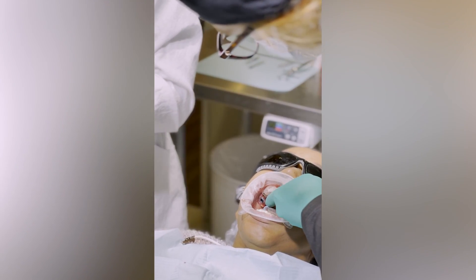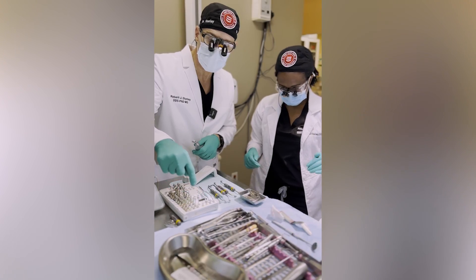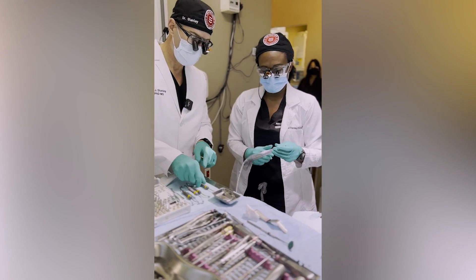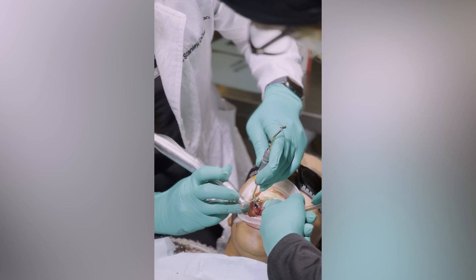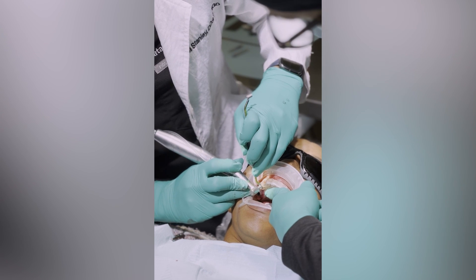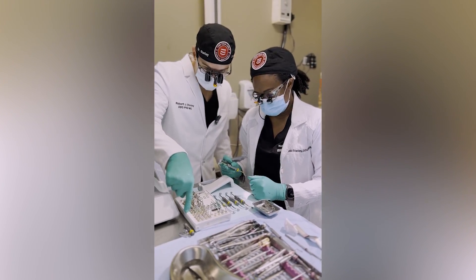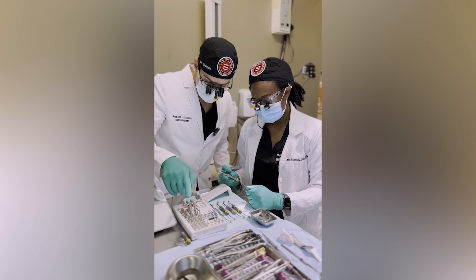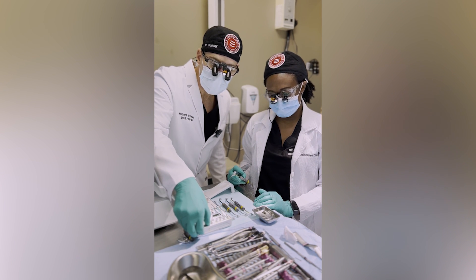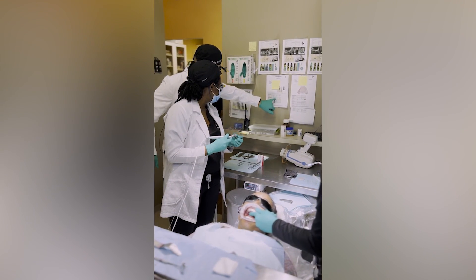We're done with the 2-0 by 21, so we're going to take that out. We know we need a 24 for the 5 position. It's a yellow, so we're going to go to the yellow sleeve starting with the 2-0 in the 5 position. Give it a good push because you're going through cortical bone. That is excellent, excellent hand work right there. This is getting bigger in diameter — every column is diameter, every row is length. Drill length 21, 21, 24. Two of the sites use 21s, and one site uses 24.